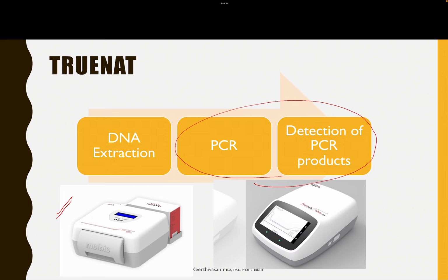Here we have this UNO DX. This is the machine which is present in most places here. UNO means single module. This is the place, a button you have to press for the chip tray to open. Other than that, there is Duo, that is 2 modules, and Quattro, 4 modules.